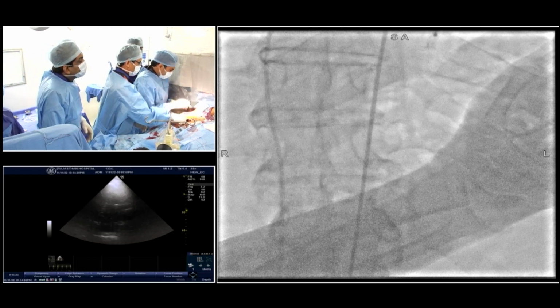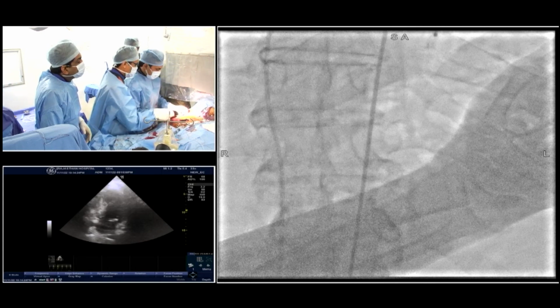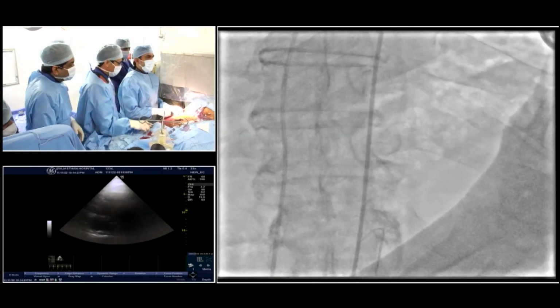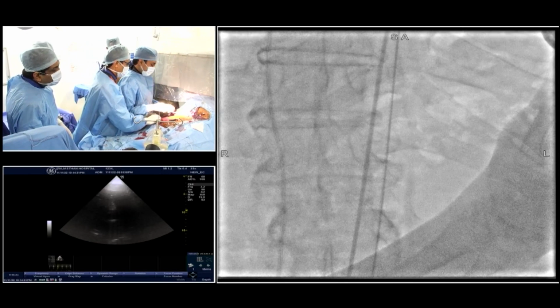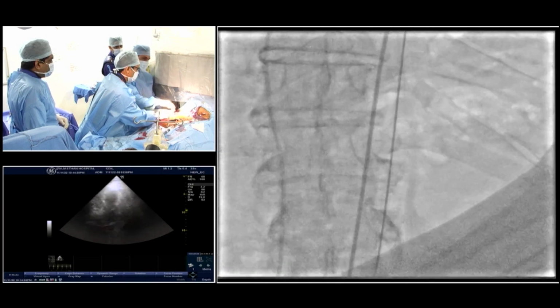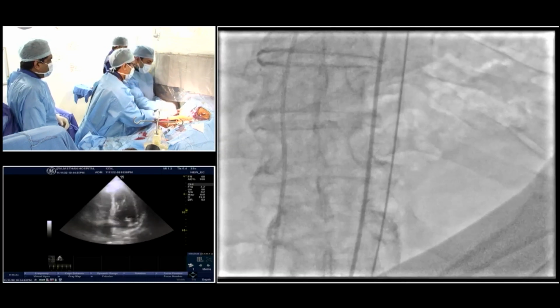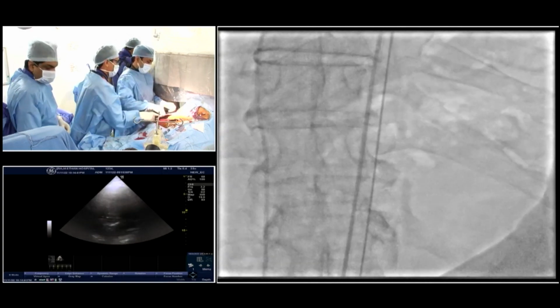So with all the discussion, if you can conclude, we want to predilate in a bicuspid aortic valve, heavy calcification, horizontal aorta, and all self-expanding valves. Are we at this consensus? Correct. All self-expanding, almost should be all predilated. Yeah. And with balloon expandable, even in bicuspids, you can get away without pre-dilatation. That's the advantage of a balloon expandable.